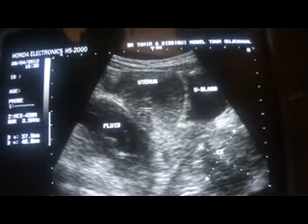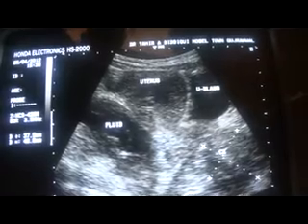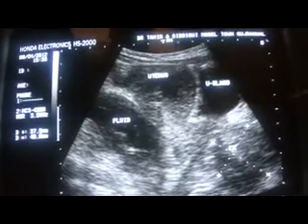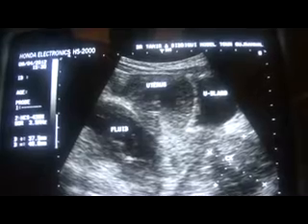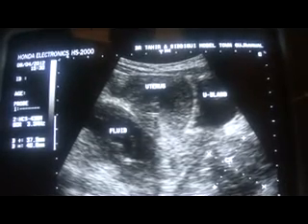Just focus on the endometrial canal, forget about everything. This is the endometrial canal with fluid, the black area is fluid. This is the internal echogenic area. These are a few fetal parts. So these are the retained products of conception in an enlarged and bulky uterus.